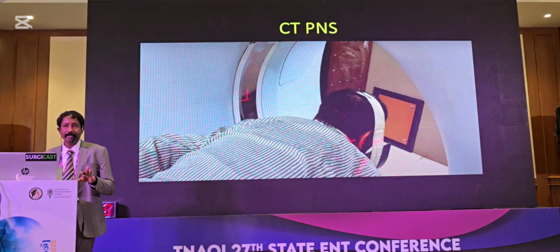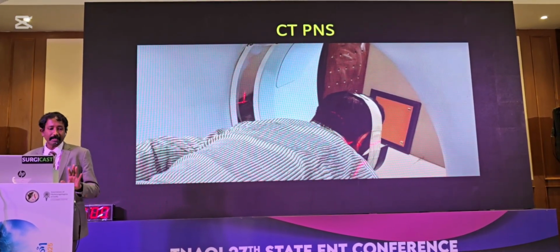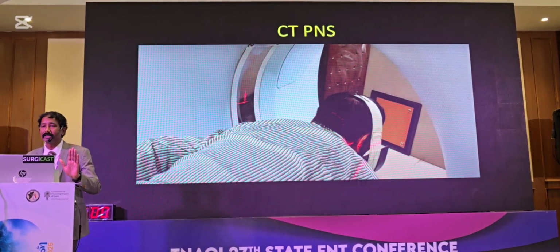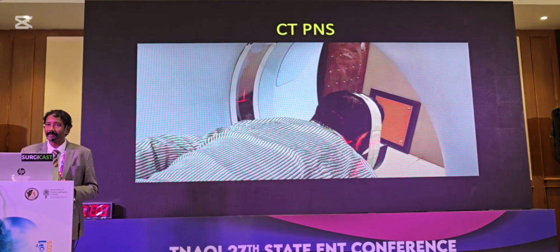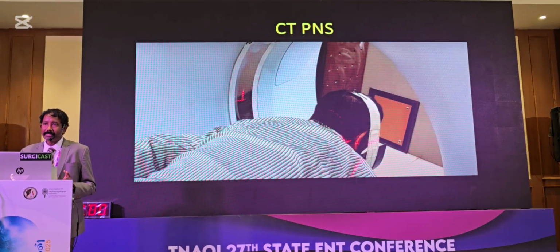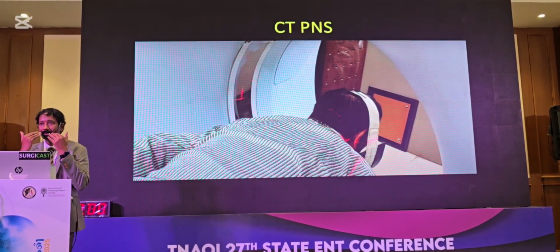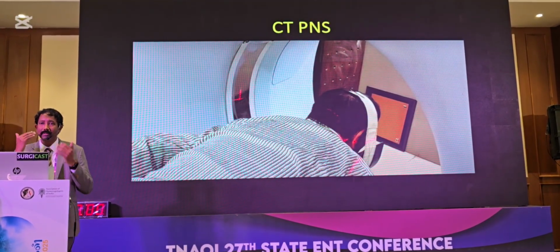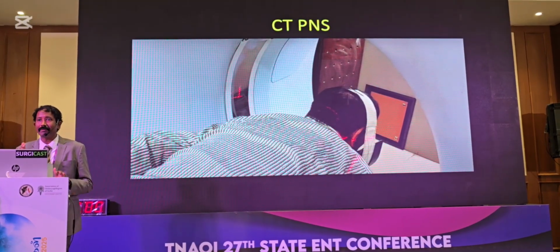So this is a CT-PNS where the coronal view is being taken in a patient in prone position with the neck extension. So here the cuts will be in coronal angle itself. So there is no reconstruction being done here. The advantage is the patient is almost like in a standing position where the fluid levels in the sinuses, especially in the maxillary sinus or frontal sinus or in the middle ear, all will be gravity oriented and you will be able to see the fluid level clearly.